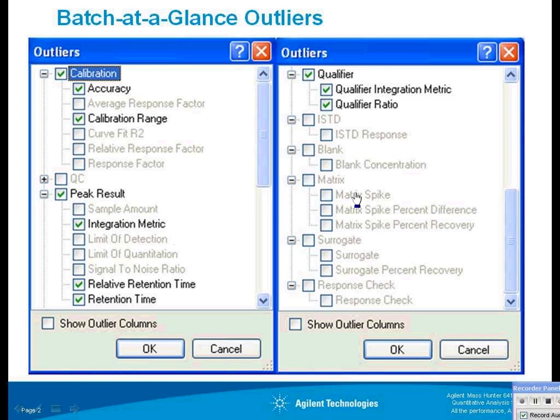If you're using matrix spikes, the matrix spike percent difference, matrix spike percent recovery. Same for the surrogate, and surrogate percent recovery. And then if you're running a response check sample, make sure that that shows a decent response. So the grayed out outliers here are turned off by default, and if your standard operating procedure requires some of these metrics, it would be useful for you to turn them on.